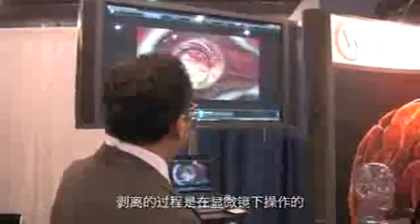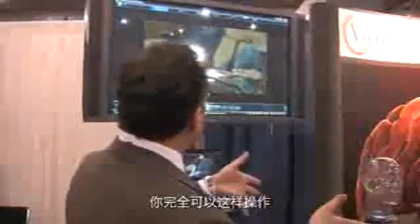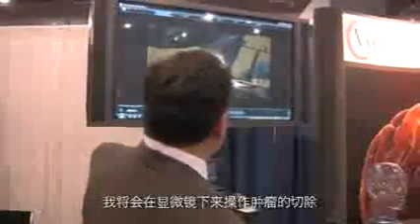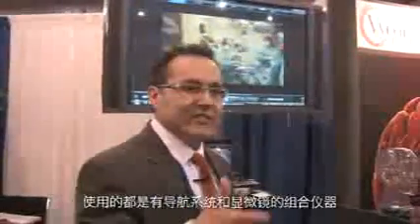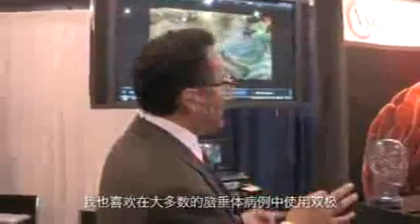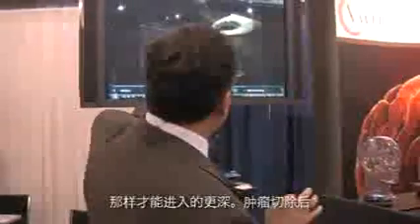This is under the microscope where we do the dissection. That's just all the amount of tissue. What you saw is what we ended up taking as we did the dissection. And other than that, the brain is separated. I'm going under the microscope to do the actual tumor resection in this case. When we're doing the tumor resection, we're using a combination of the navigation system as well as the microscope, going back and forth with the small suction device, a little bit of bipolar. I like to use the bipolar that we use mostly in the pituitary cases, which is a long bipolar, so that we can go deep.